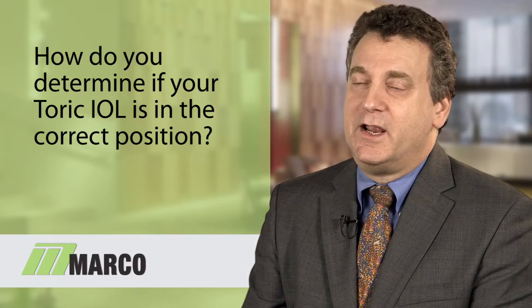But there will from time to time be patients, either in your own practice or that you see in consultation, where their expected outcome with the toric implant isn't as spot on as you want. One of the beautiful things about the OPD-III scan is it allows you to take a retroillumination image that lets you see the toric marks and place on the eye a reticule so you can see the exact axis that toric lens is sitting at.